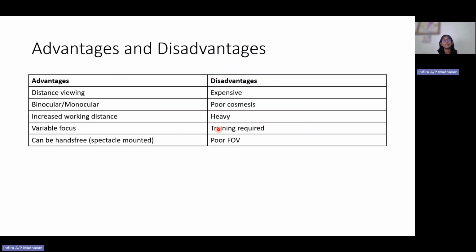And then in certain countries like the US and UK, there are limited places where low vision patients with certain visual acuity, with the help of a bioptic telescope, are still allowed to drive. So for that kind of patients, we prescribe them binocularly, but the rest of it is usually monocular.